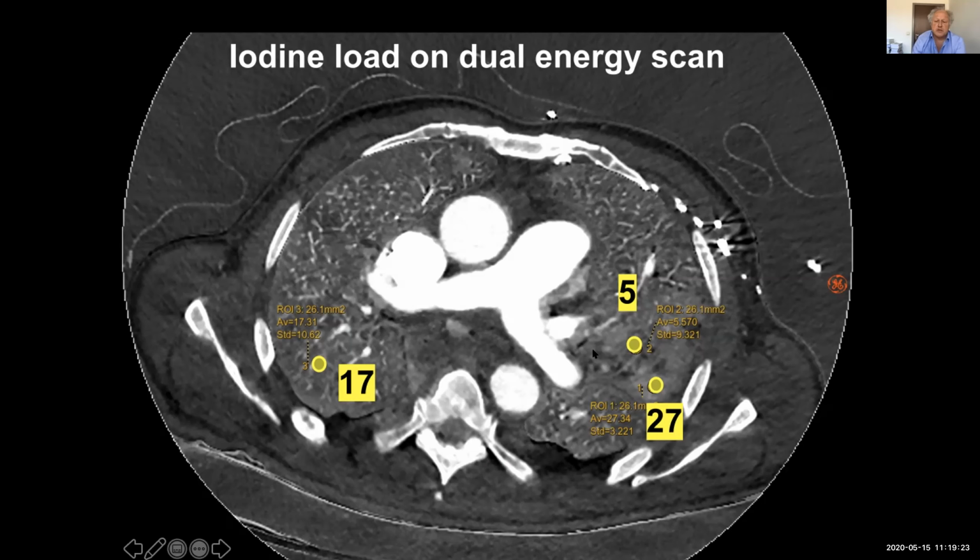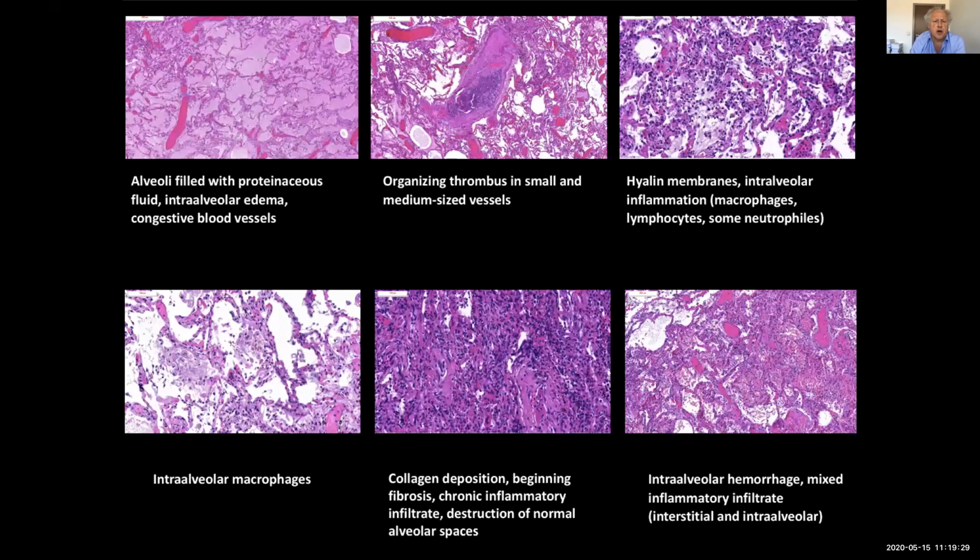So that patient died 2 days later due to organ failure. And we also have the autopsy images of that patient. And then you see nice filling up of the alveoli. You see the clots in the small and medium-sized vessels. So this was probably the cause of his fast deterioration.